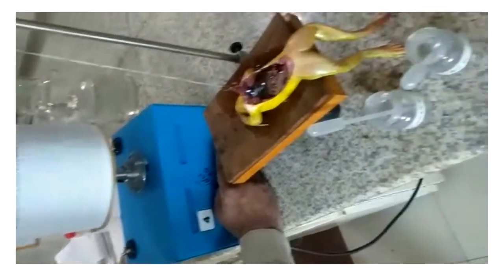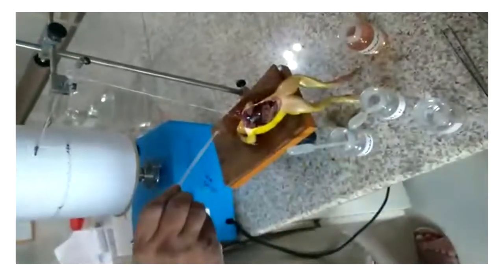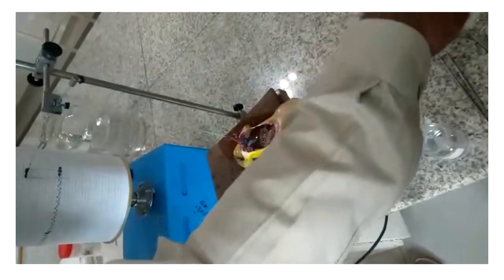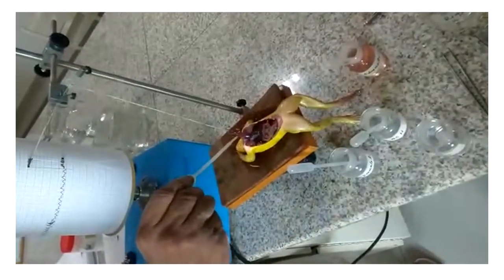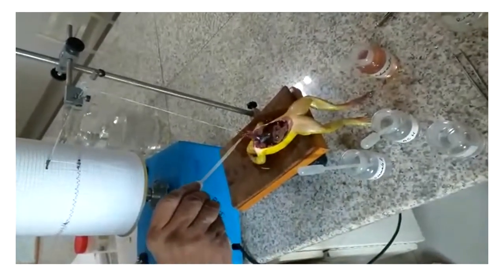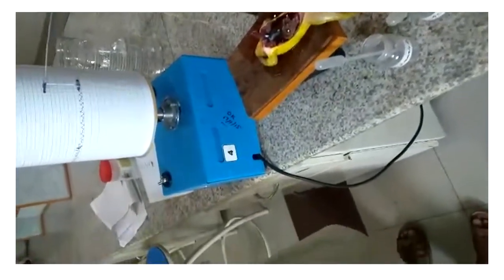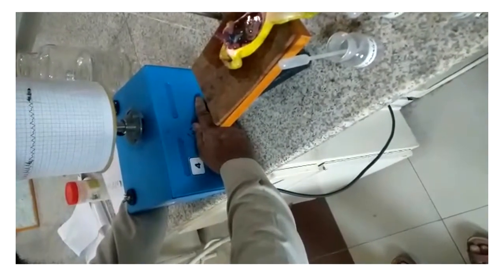Now we will wash it with ringer. Now we will take the normal reading again. Start.